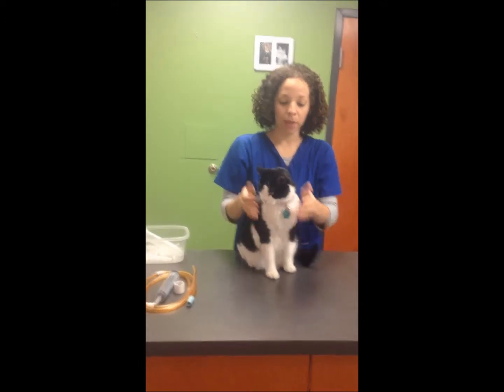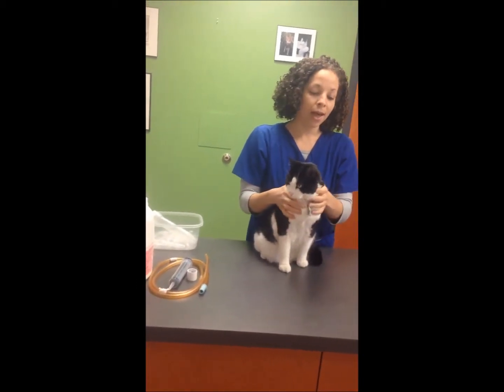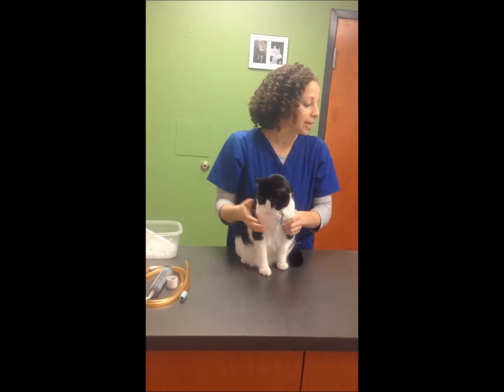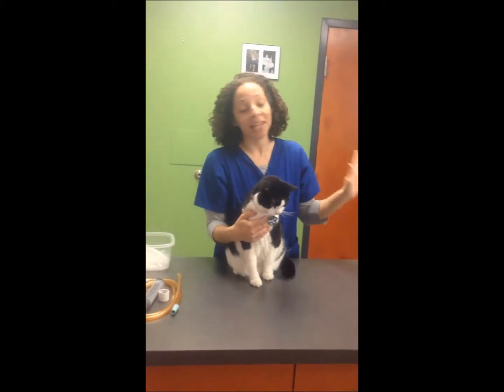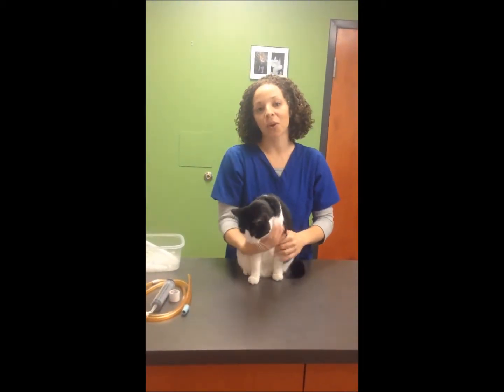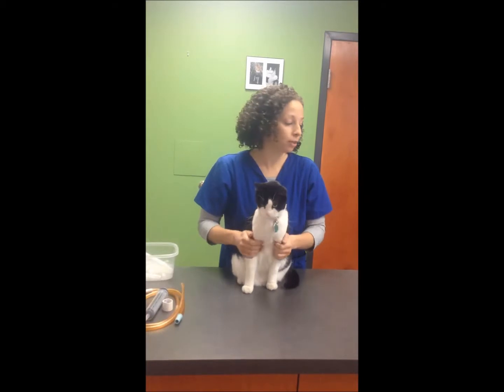And essentially some of the indications for why you would want to consider doing an upper GI contrast study would be persistent or acute vomiting or diarrhea that hasn't responded to treatment previously, anorexia, blood in the stool, different things like that. Or if you suspect that there are lesions or masses, that's Peggy, our other clinic cat. Or if you are concerned that there are lesions or masses in the gastrointestinal tract that you want to be able to locate on radiography.